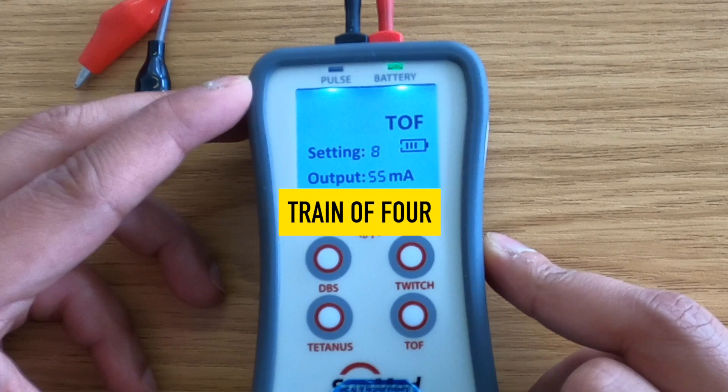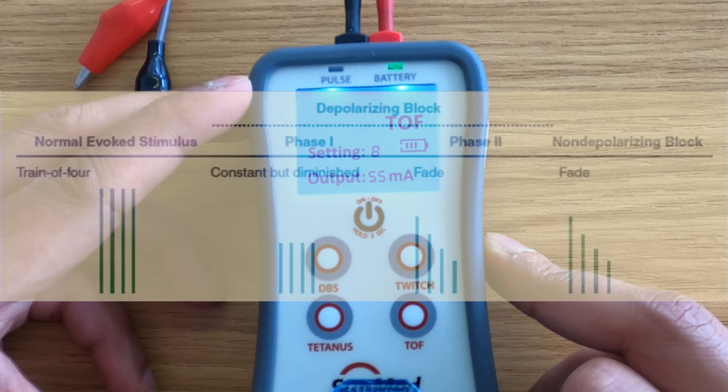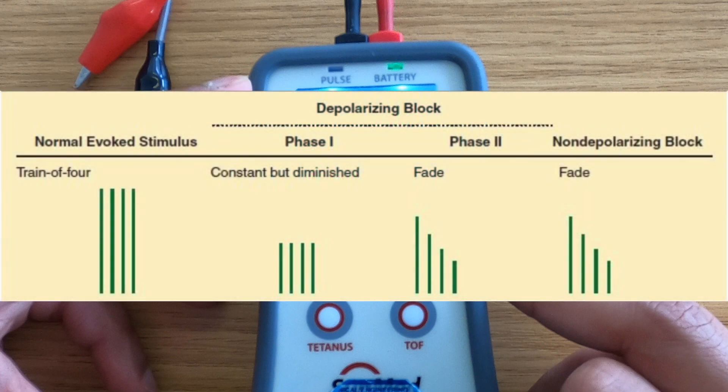Train of four or TOF generates four equal intensity single pulses in a period of two seconds. A 15 second period between stimuli is recommended to prevent post-tetanic facilitation.